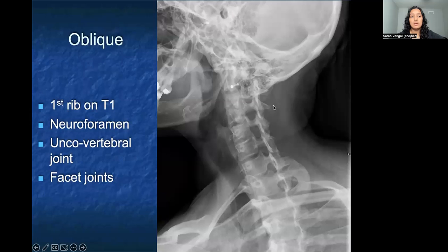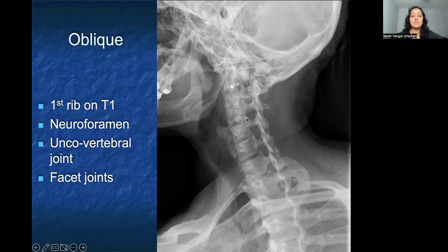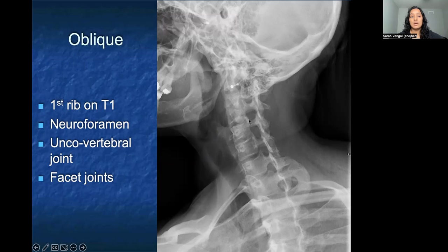On the oblique view, you can count vertebrae up from the first rib — C7, C6, 5, 4, 3, and 2. The huge benefit of the oblique view is that you can see the neuroforamen, where the nerves are supposed to come out. The uncovertebral joints are just anterior to those neuroforamen, and if they have increased arthritis there, it could be narrowing the neuroforamen. Posteriorly, when looking at the facet joints, significant arthritis there could also be a reason someone has narrowing within that neuroforamen.